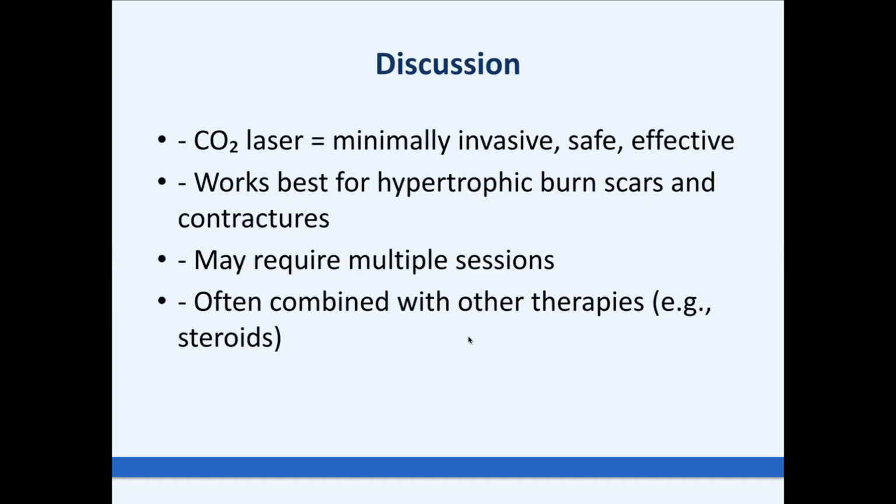Discussion. CO₂ laser is easy. When you have an operation, the patient needs a pre-operation period, some preparation, and also a period after the operation, a stay at the hospital, infusions, medications. But with CO₂ laser, it's much easier.